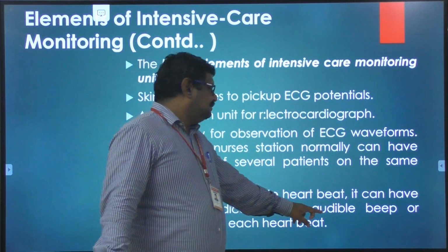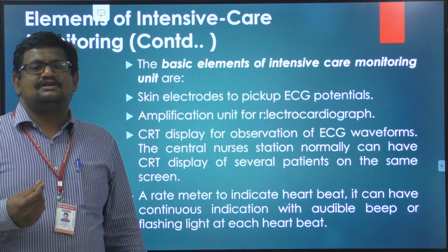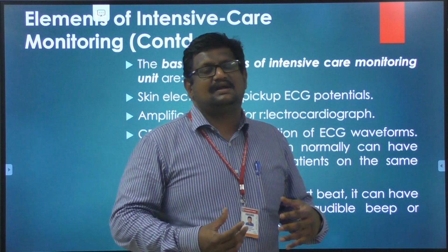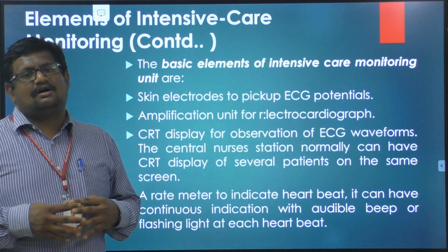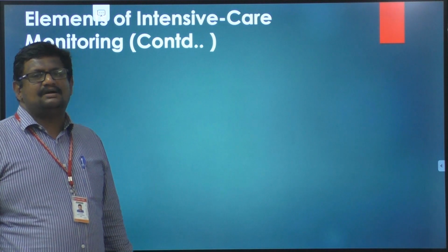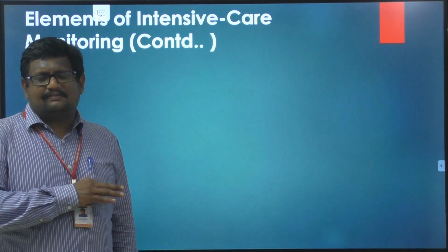Generally we know the audible beep sounds with each heartbeat in the intensive care unit. So it becomes very involuntary for the physicians. It becomes very comfortable because whenever there is a stoppage of sound, they can immediately react, understanding that the heartbeat is lowering. So these are all the additional points we are studying in the intensive care unit or patient monitoring system. Apart from that, everything we know.